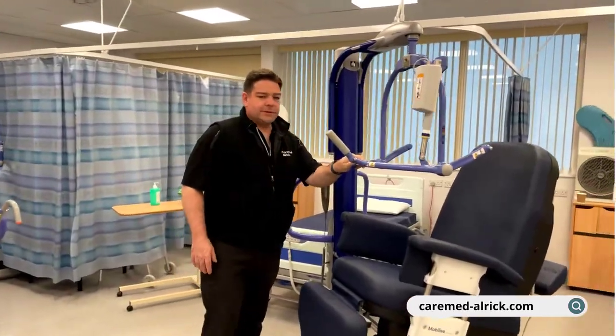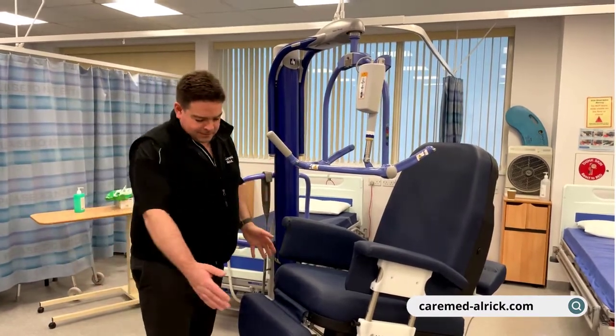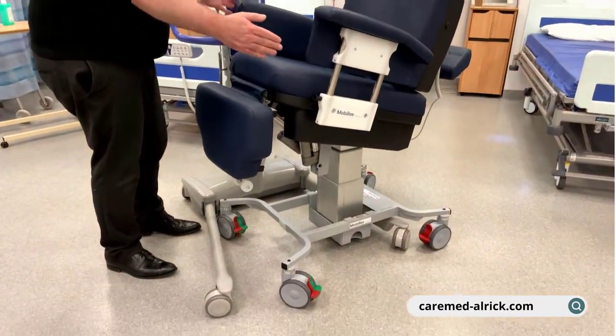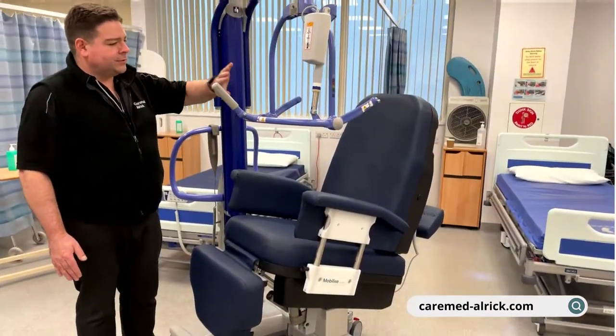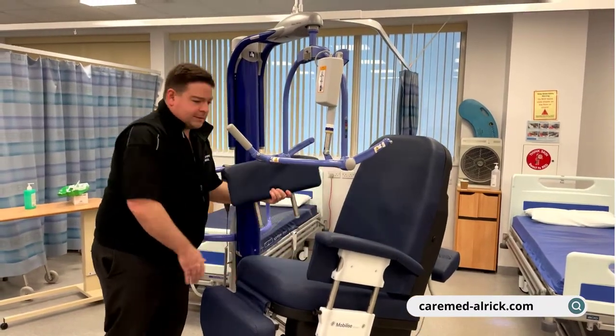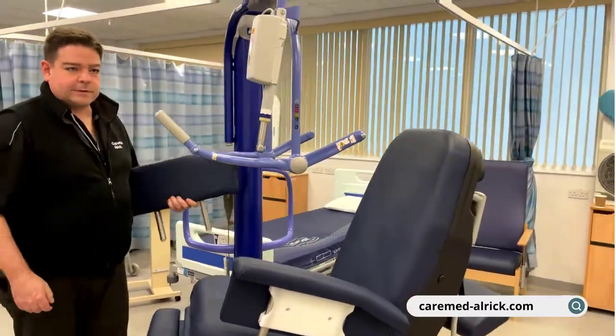Using the Maxi Move, which is very popular in hospitals, there's ample foot room to bring the hoist in from the front. Or if you're coming in from the side, as shown here, which gives you very far back positioning — simply remove the arm and you've got no obstacle, then come across.